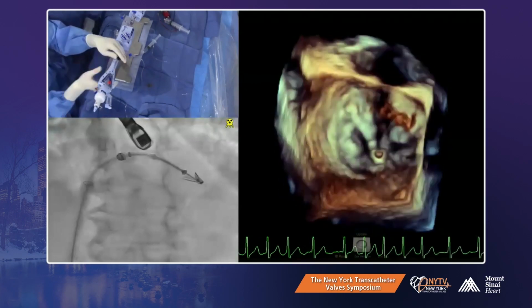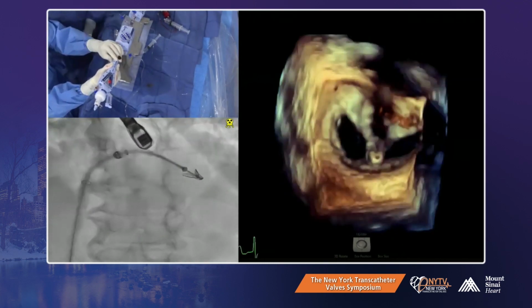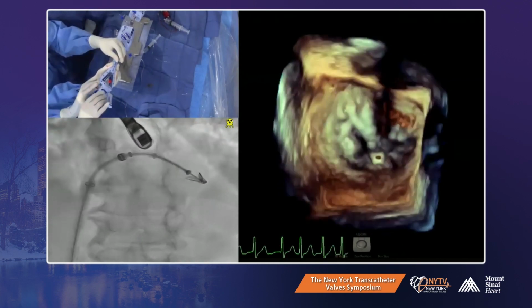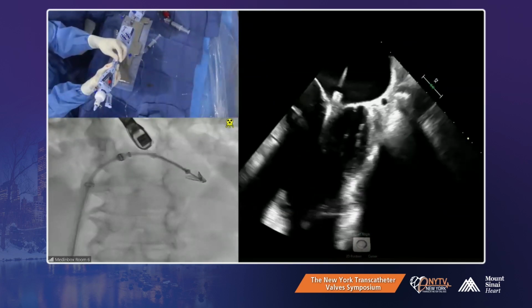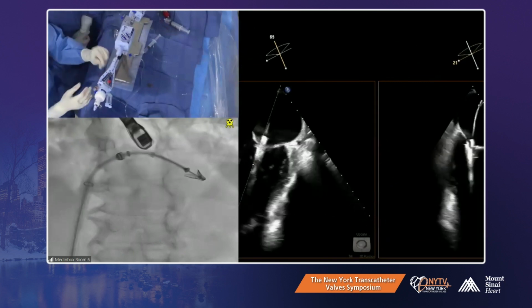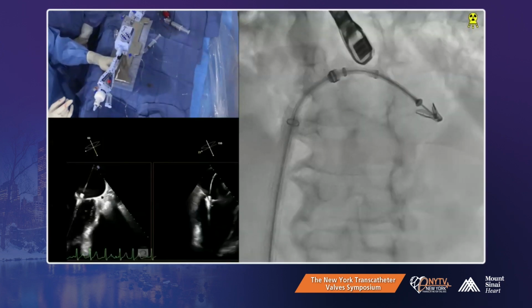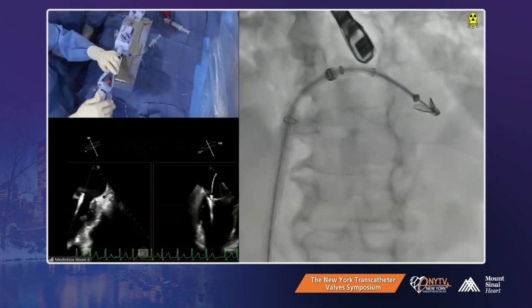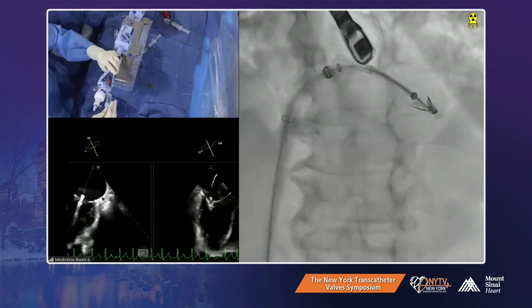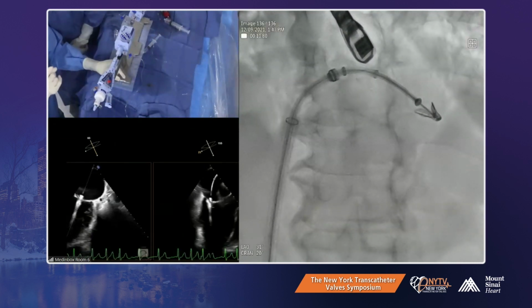So what do you say? Give it back, medial. Lateral, lateral. The color change is not close. There's something wrong going on there, you're saying. I agree. It looks distorted to me still. It's angled a little bit. And the MR reduction has not been very much. For this big a clip, you should have some MR reduction. I think the clip has not fully closed. So I think what we're going to do, we need to troubleshoot because the clip is not closed fully.